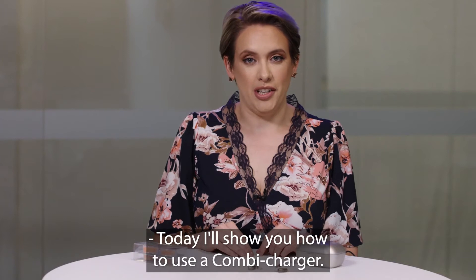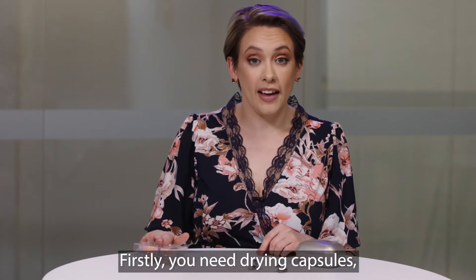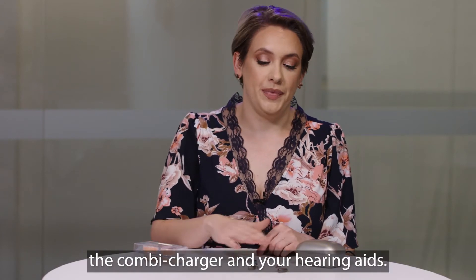Today I'll show you how to use a combi charger. Firstly, you need drying capsules, the combi charger, and your hearing aids.